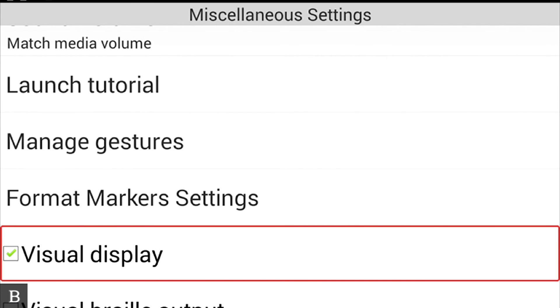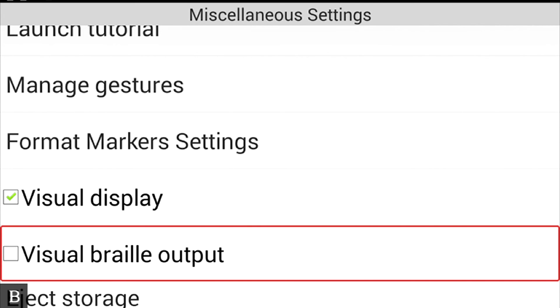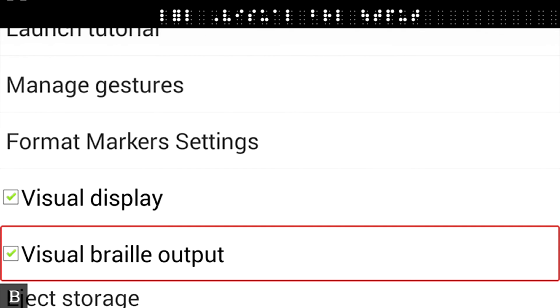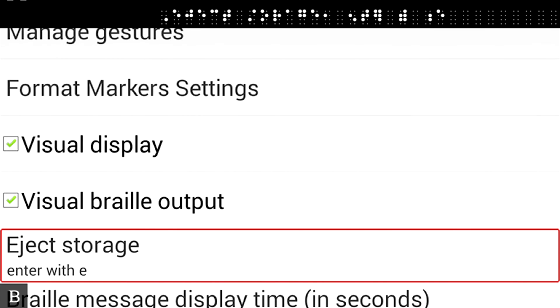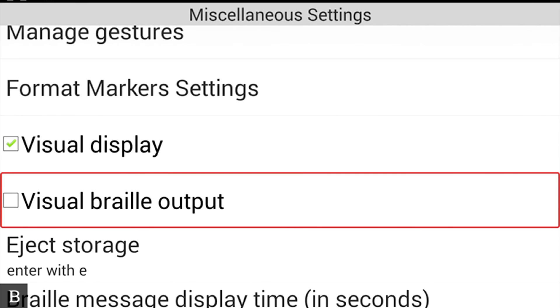Visual Display is a checkbox that is currently checked. You can turn the screen off visually on the BrailleNote Touch — many people who cannot see the screen may turn it off, which saves a lot of battery. Visual Braille Output is another feature: when enabled, you can visually see on screen the content of the Braille display. Teachers may really like this — as a student is working, you can see what's on their Braille display shown at the top of the screen.